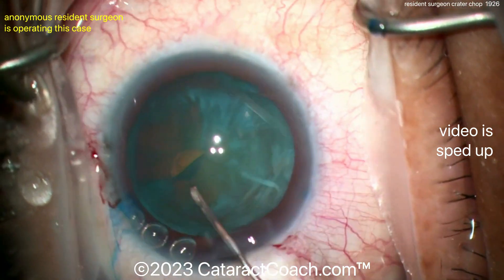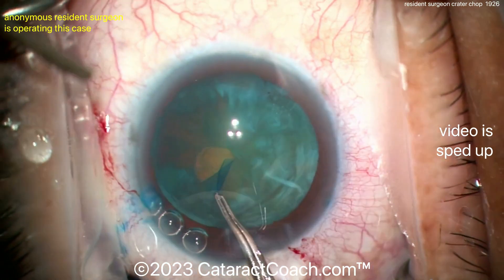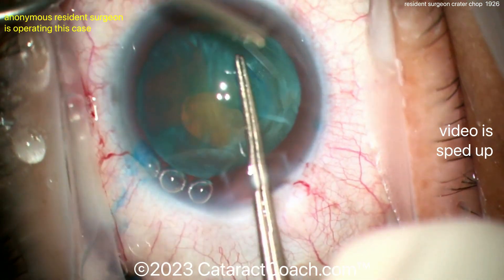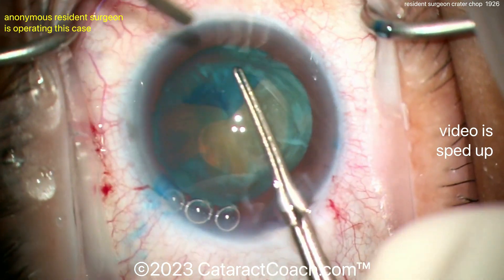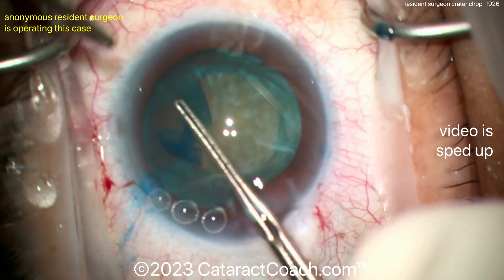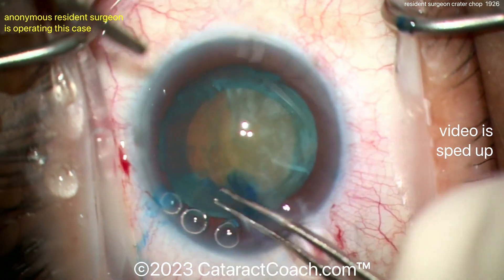The rhexis is starting with a cystitome — that looks good. We're aiming for about a five to five-and-a-half millimeter rhexis. Very nice technique here; this is pretty darn good for case 100. The instrument is pivoting in the incision and not distorting it.